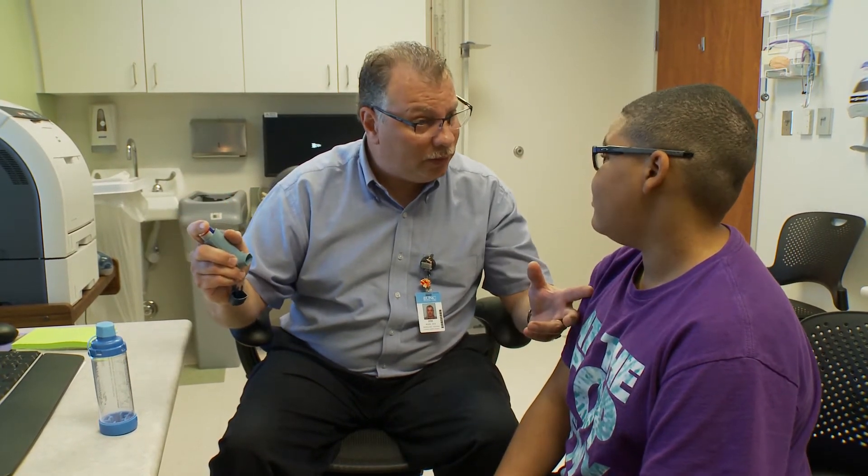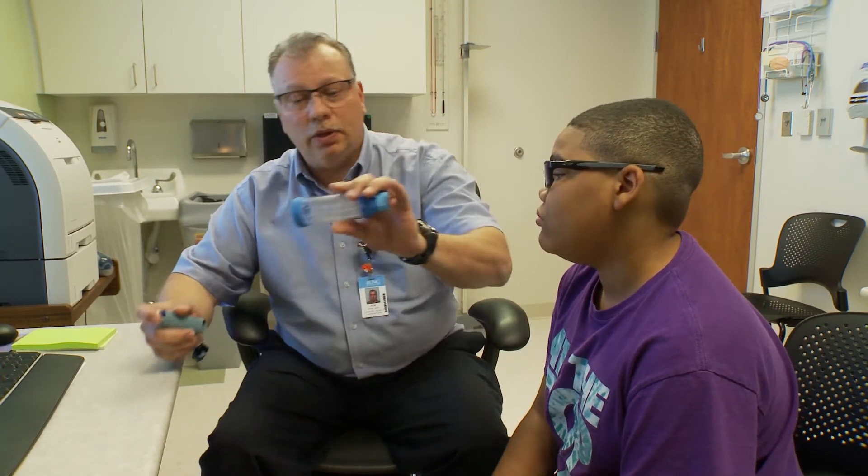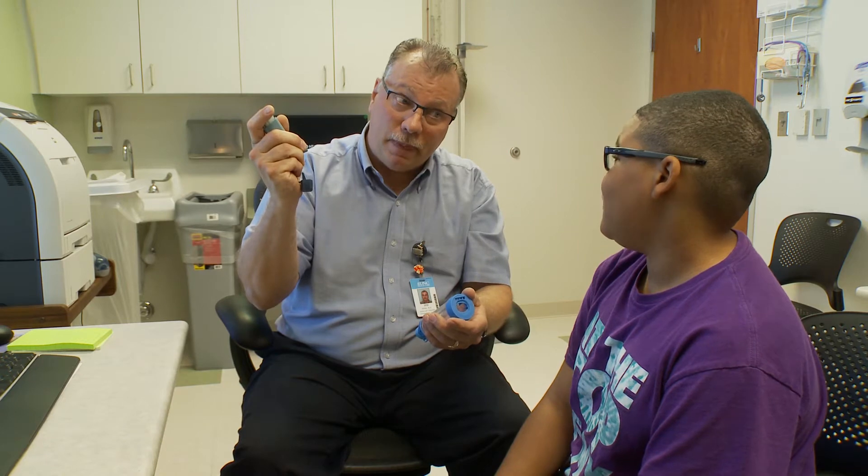Now that we've got it primed, we're going to go ahead and try to give you a treatment. We're going to use a spacer. Never take this and put it in your mouth directly — you lose 80 to 90 percent of the medicine. We don't want to do what your friends do; we're going to do what we need you to do.